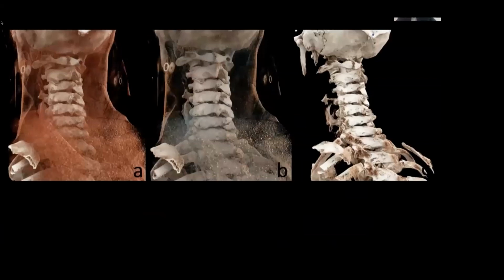Now a corollary to that would be, well, could we use this? Because when you say something's reliable, you kind of have to say reliable for what exactly, right? So if you were planning to use this, and we can go on various tangents, but just briefly, things like augmented reality or virtual reality, or using this as overlays in surgery.